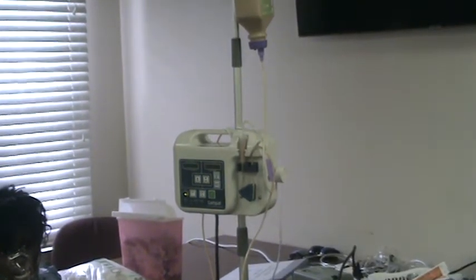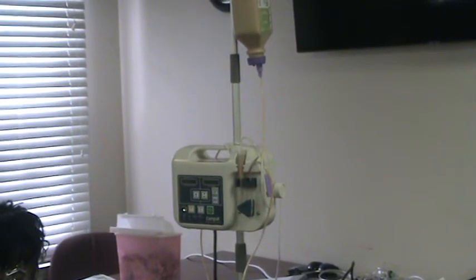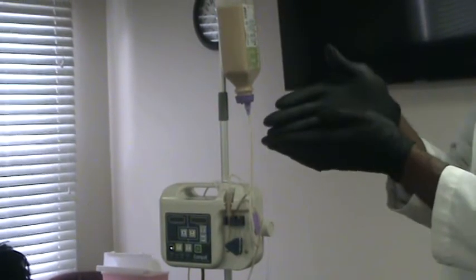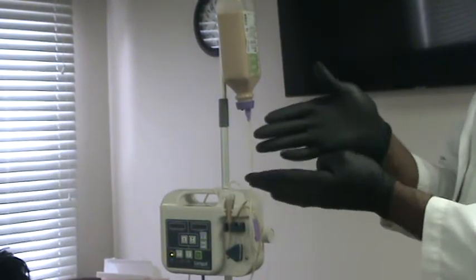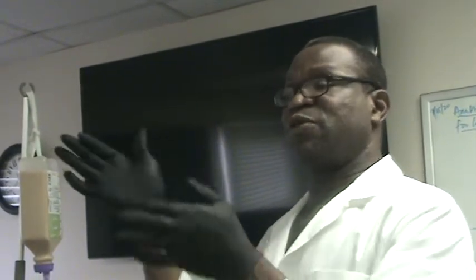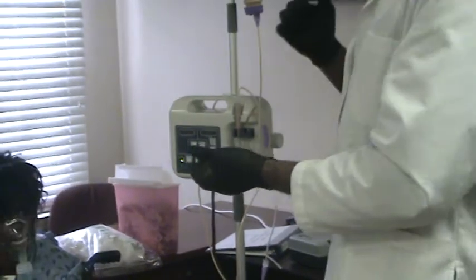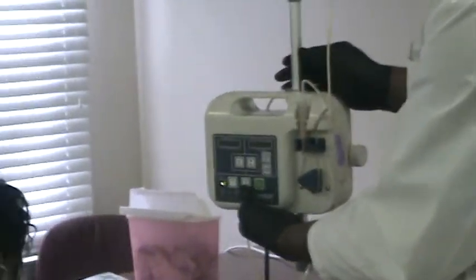That's why the owner will always say until finished. Because let's say you can't just stop the feeding at 2 a.m. when it's scheduled to stop if the feeding has not finished, because she was interrupted several times during the time the feeding was on. She didn't get her complete feeding. Then she might be losing weight if she's not getting her complete feeding per day. So the best thing to do is not to turn the machine off to provide care. It's to put it on hold.